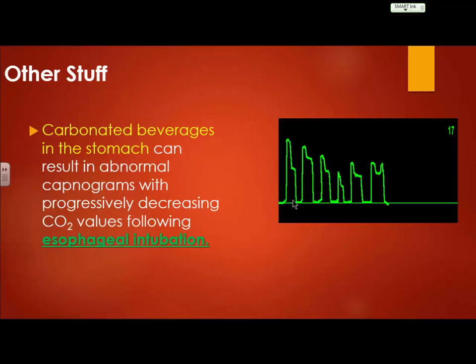All right, so other stuff, of course, carbonated beverages in the stomach can result in some abnormal capnograms. It's going to be kind of far-fetched to see something like this, though, even this. You probably had to guzzle a lot of CO2 to have something that's going to give you any kind of waveform in the stomach, because what does the stomach not do when you push air into it? Yeah. All right.